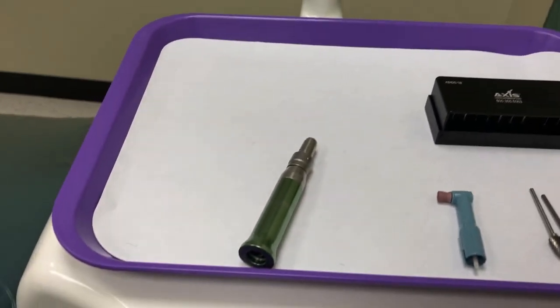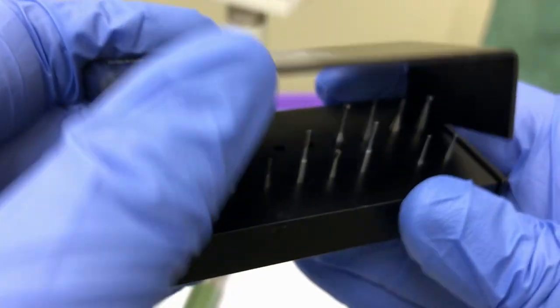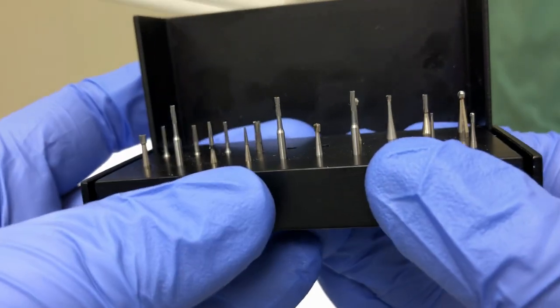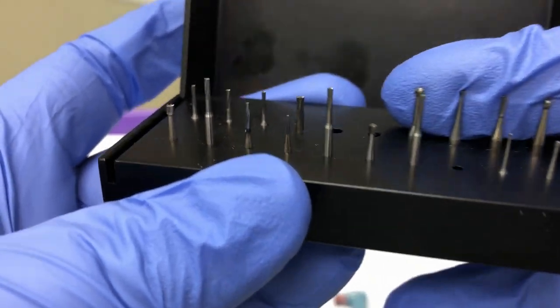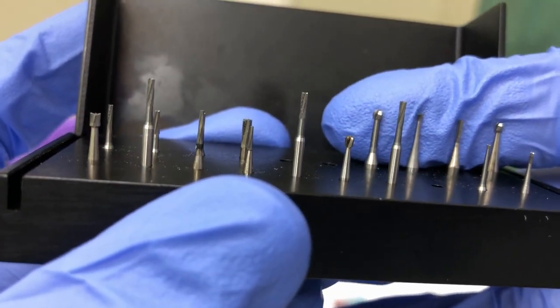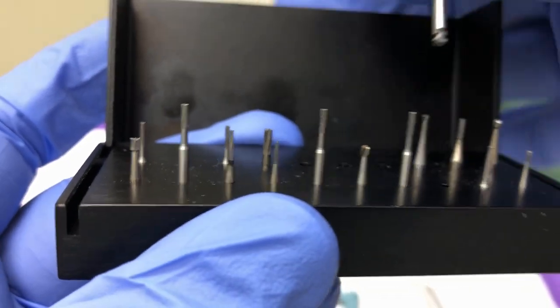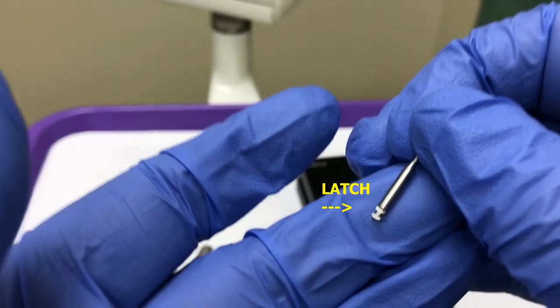For this example, we're going to select a number four burr, which is a round burr. Make sure you select a right angle or latch style attachment. You must have a latch style attachment to fit into the contra angle. The high-speed handpiece used a friction grip burr.